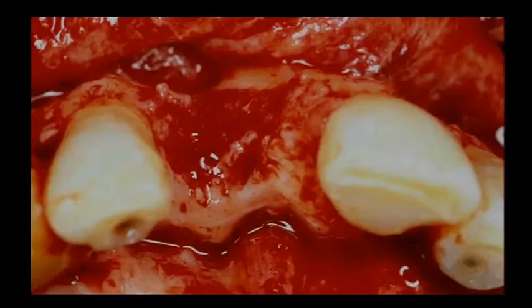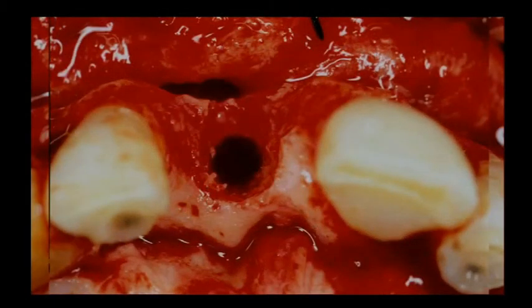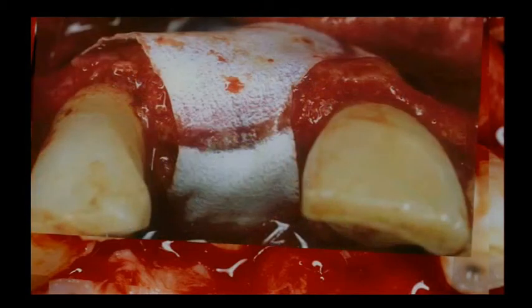Good. Well, our goal is to place our implants in the bone, and if the buccal bone is lost, as you see here, we have to do something. I place my implant slightly palatal, and that's the 3D implant placement. And we already know that it's wise, especially as George told us, if you have bone resorption because of the biologic width, which is going to establish here, we need at least 2 millimeter bone, and it's not bad at all to over contour this area a little bit. So this is a predictable way of building up bone if we need this.